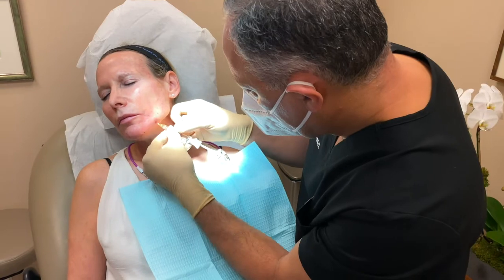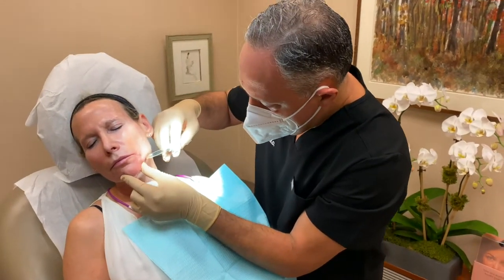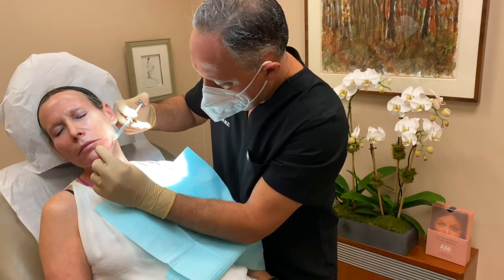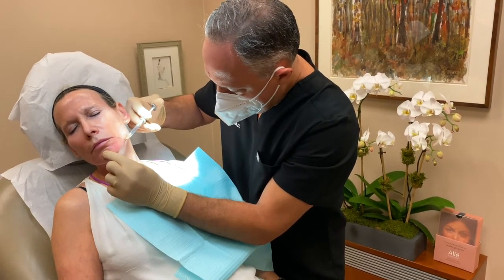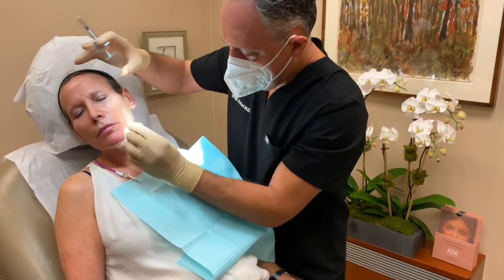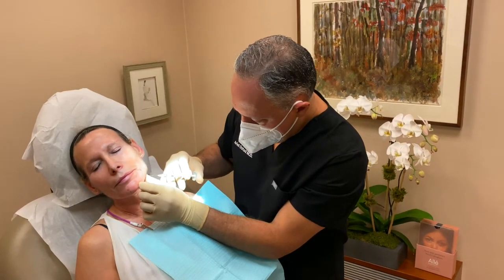She's a little bit hollow in the corners of her lips. I'm just putting little drops. And it's about really injecting slowly. And then again, addressing what we call the pre-jowl sulcus. And then just making sure we bring the chin out a little bit. Love your results. You're going to see the incredible definition.